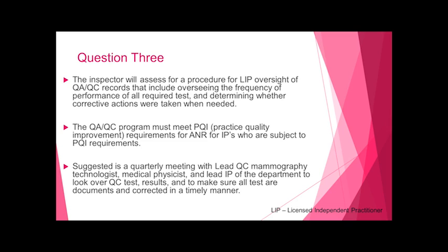So the suggestion is quarterly meetings with the lead QC mammography technologist, medical physicist, and lead interpreting physician of the department to look over the QC tests, make sure they're written down, make sure the results pass, and make sure that it's all documented and signed off by the technologist. We do this once a quarter at our facility. It's great that they keep up with this, because like I said, this is the heart of the department.